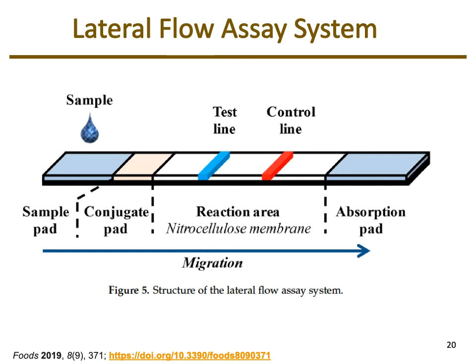Now with the lateral flow assay system, these sometimes are referred to as snap test or dipsticks, and so in this case you put a sample in the area that's labeled sample pad, and then either this could be in a cassette, like they are for the snap test, or this could be just like a dipstick that you use to check glucose, right? And so you put your sample on, what happens is that because of the properties of liquid, it ends up moving towards that other end where the absorbent pad is.